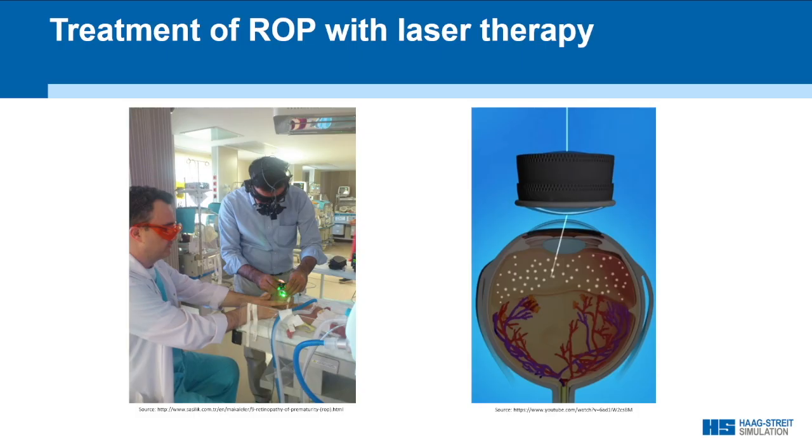As a brief recap, when a baby is diagnosed with ROP and pharmaceuticals are either unavailable or ineffective, laser therapy becomes the ultima ratio treatment option. The purpose of the laser is to treat the avascular areas of the retina so that these no longer emit VEGF. By doing so, we stop the uncontrolled growth of blood vessels. To achieve this, the entire avascular area beyond the borderline must be treated with laser spots, as you can see here in the right image.